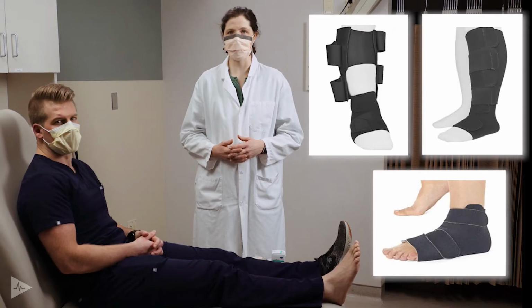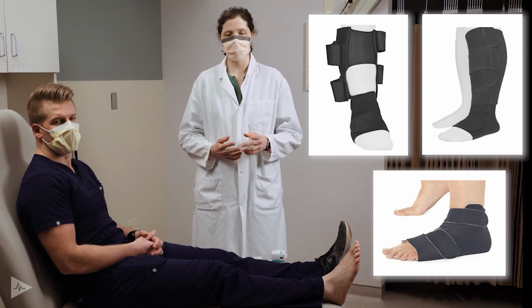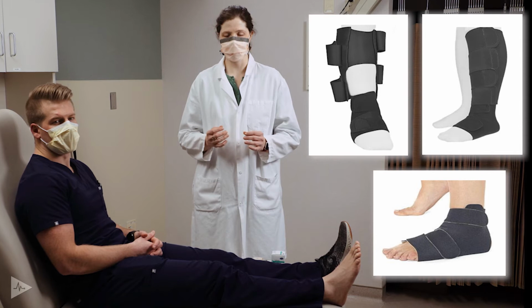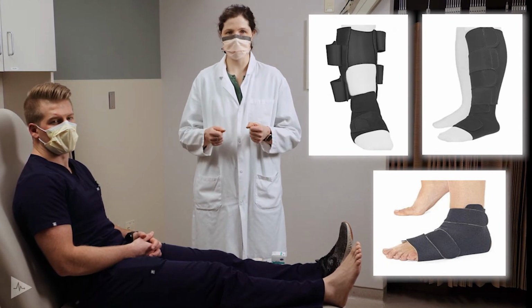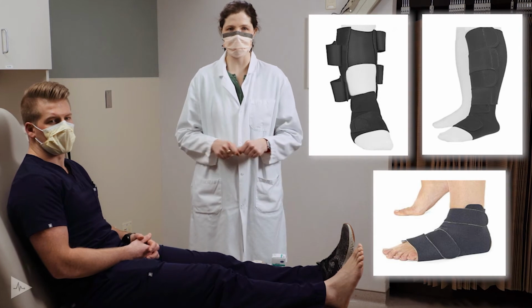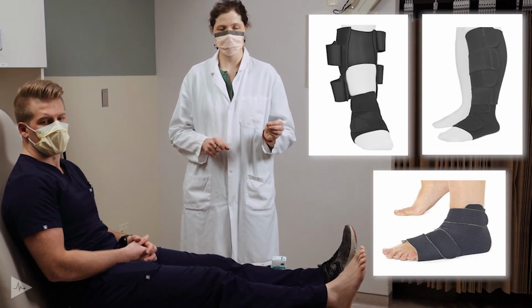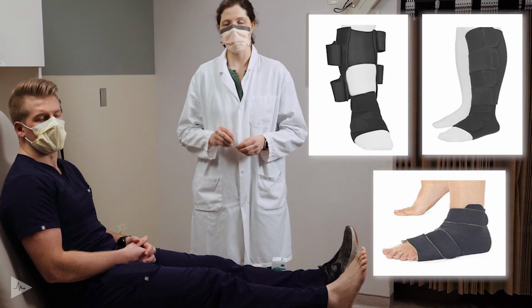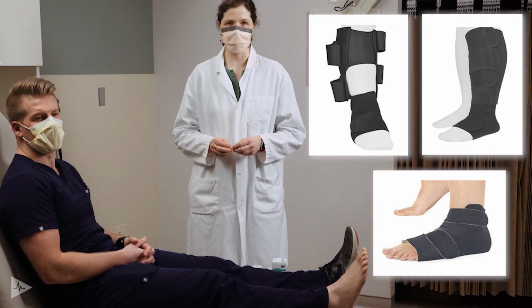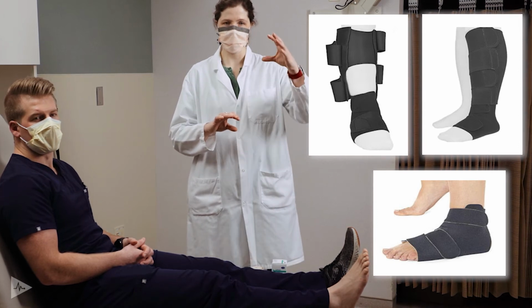These are some additional Velcro compression devices that can be used if patients have trouble donning stockings. These Velcro compression wraps will pull over the leg, and then they have several different pieces for closure that crisscross on the anterior shin. They come with a foot piece, as you can see in the photo, or they may come with a stockinette to add additional compression throughout the foot and ankle before that joins the Velcro wrap continuing up the leg.